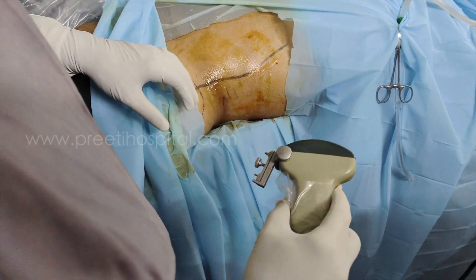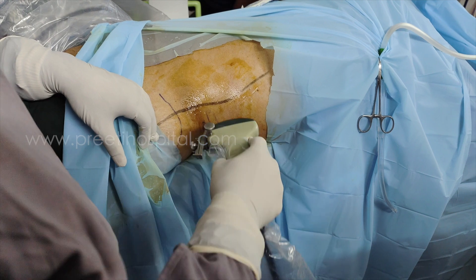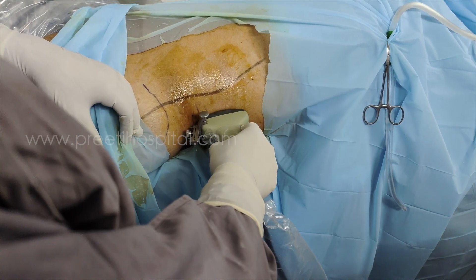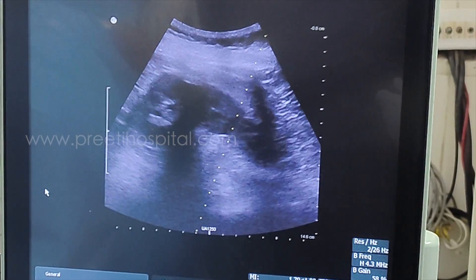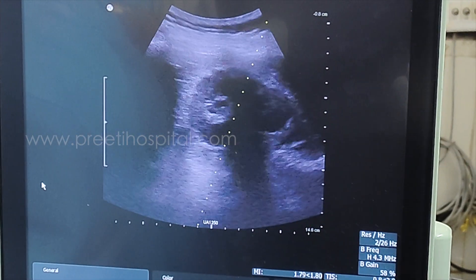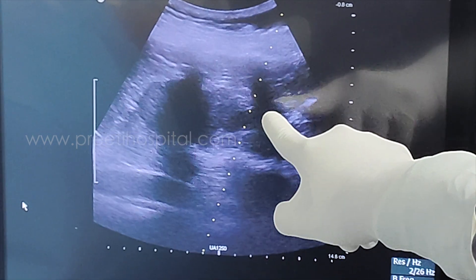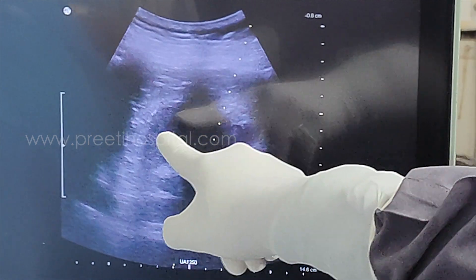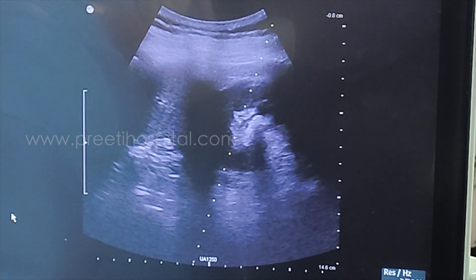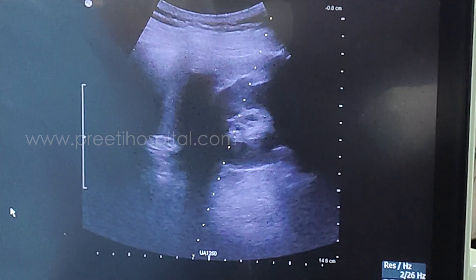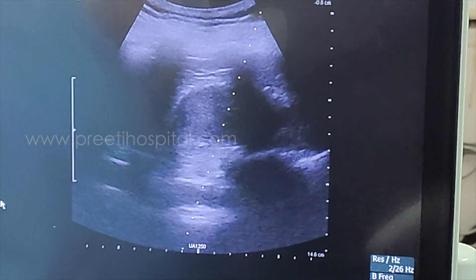When we do ultrasound in supine PCNL, the primary aim is to identify the loin region and keep the kidney like this. When you have doubt, if you go up you will understand which is the lower pole. Whenever you are going up, that is the upper pole. Automatically when you come to the anterior, the spleen will come — you can see the spleen. Under the shoulder of the spleen you can see the rib, vertical ribs.